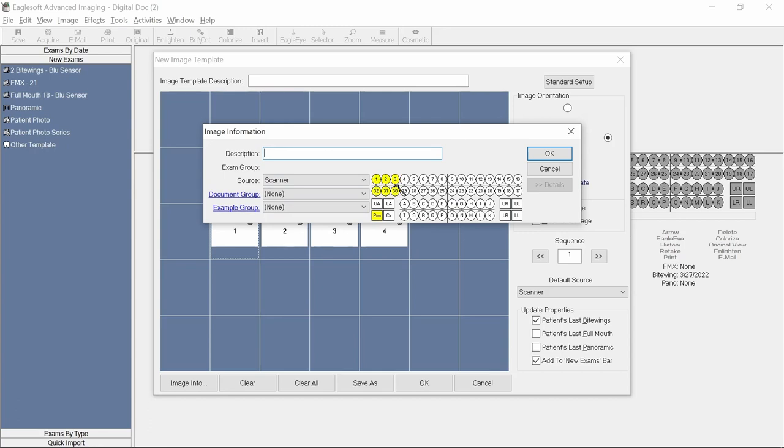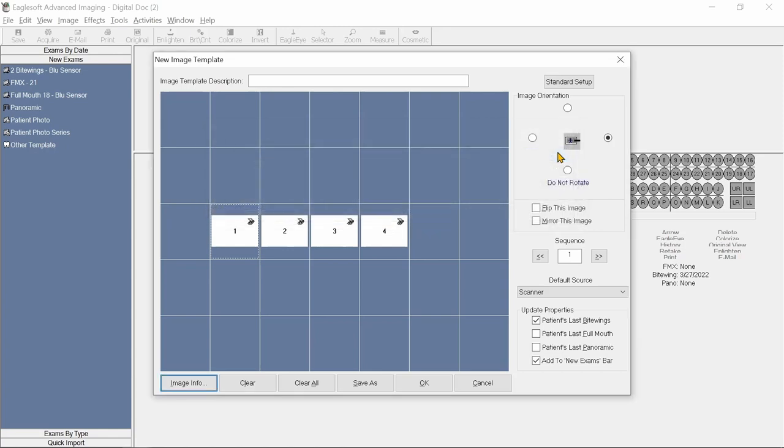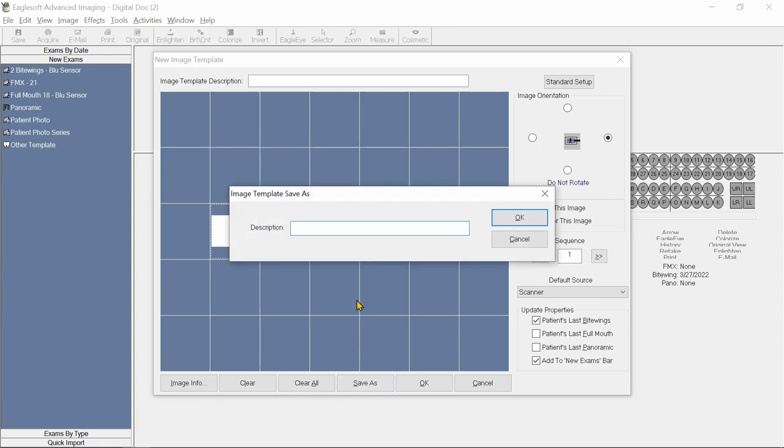For each individual image in the mount, the office can go to Image Info and select which tooth numbers are going to be associated with that image. You'll need to perform that task for each individual slide. We'll save the mount and give it a name here.